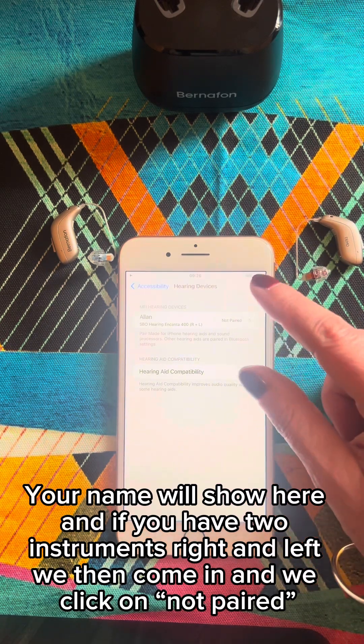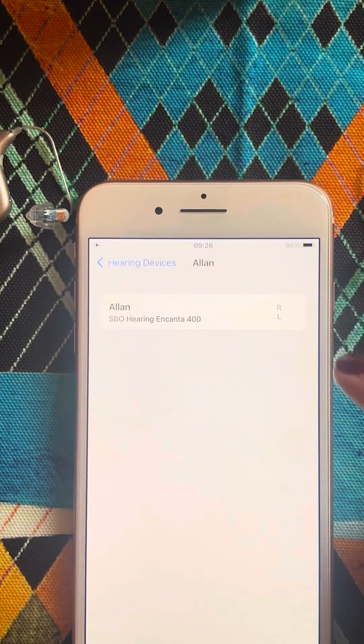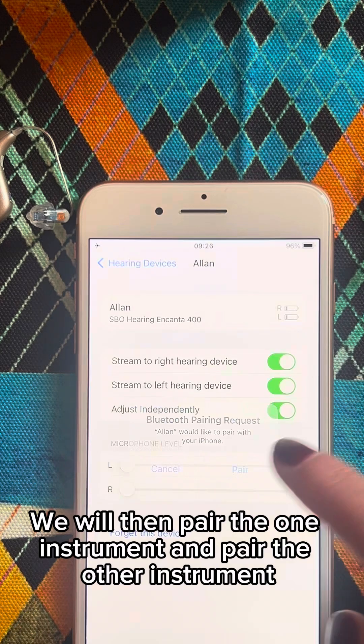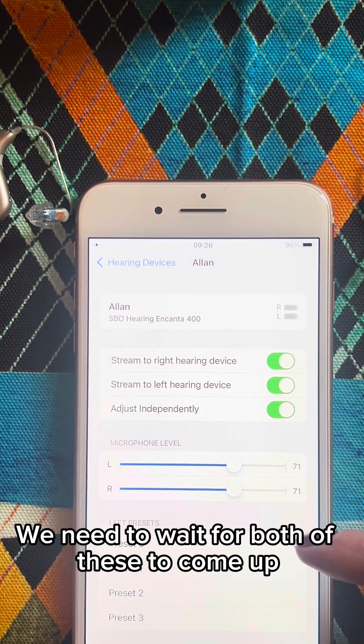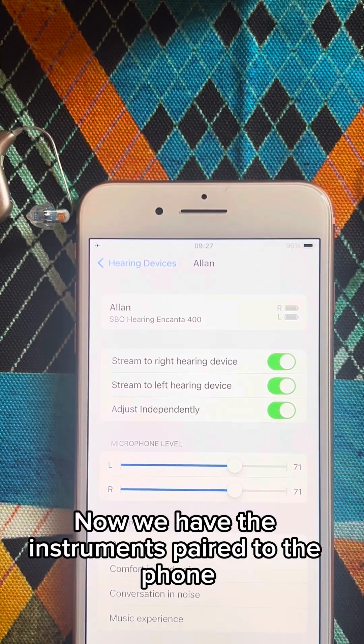If you have two instruments, right and left, we come in and click on 'not paired'. We will then pair one instrument and pair the other instrument. We need to wait for both of these to come up. Now we have the instruments paired to the phone.